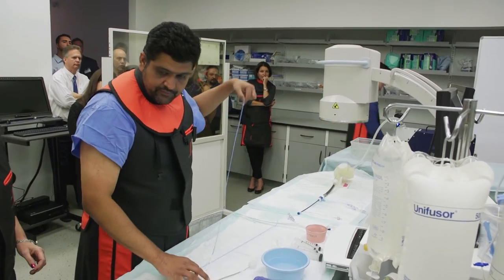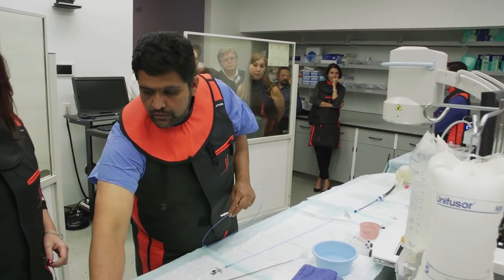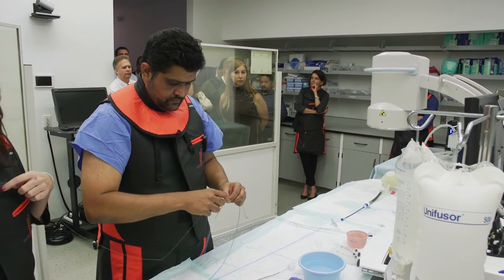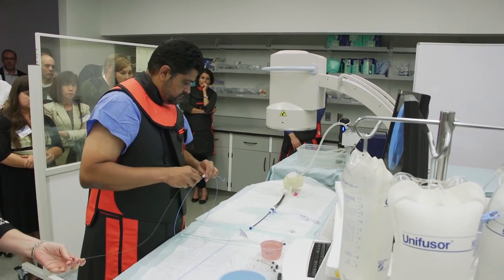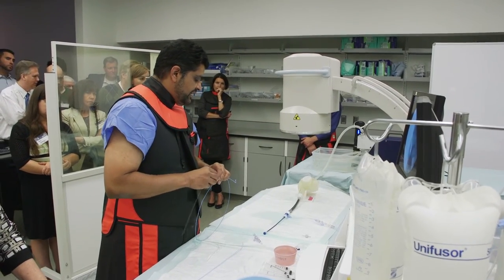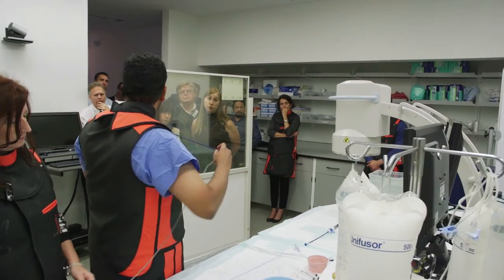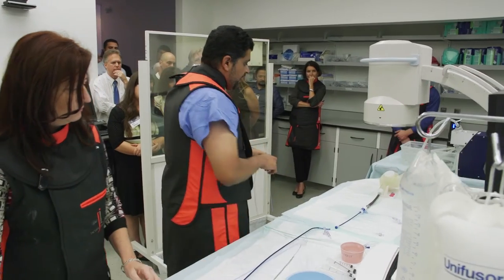The next step would be to take a device like this pigtail catheter, which we use to inject some contrast. What I have across in the left atrium right now is only a transseptal sheath — it's not what we use to deliver the device. The device is actually delivered through a bigger sheath, a 14 French sheath. So what we typically do is put in a stiff wire across.